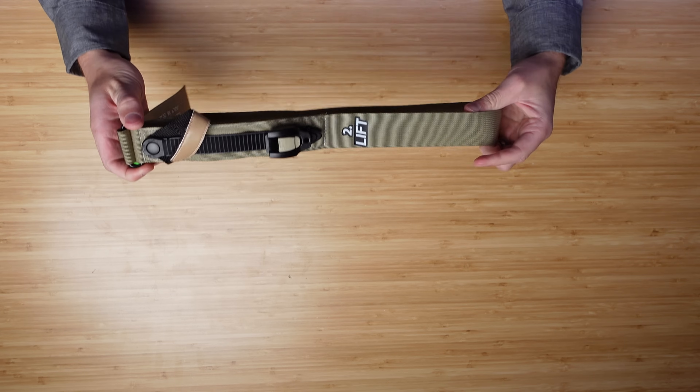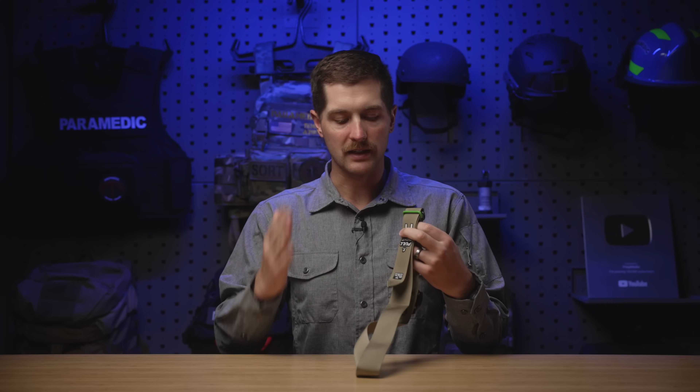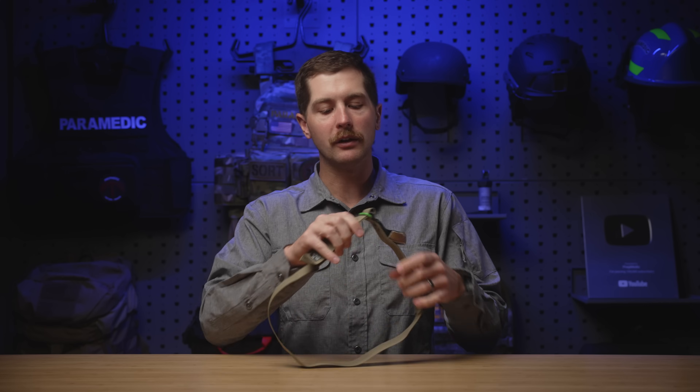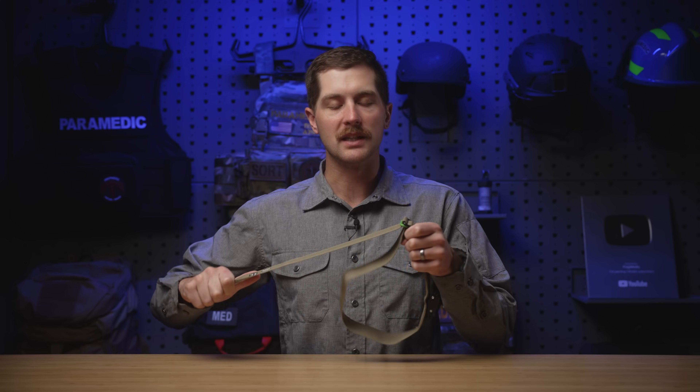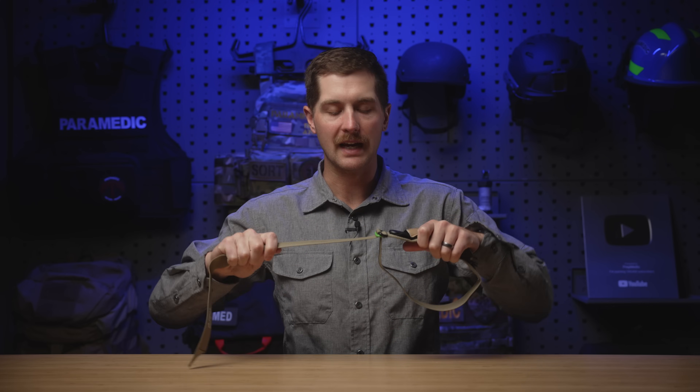Let's talk about use and why I like it and what some of its limitations are. This tourniquet is placed like any other tourniquet. It does not have a Velcro latch, which brings me to the first use case: if you are doing any kind of aquatic operations, you're a scuba diver, you spearfish, or you're somewhere with lots of mud, dirt, or grime, I really like these friction locks because they're not going to get gummed up. The CAT tourniquet has two sides of Velcro, which works great, but once saturated with mud or water, that Velcro is not going to stick as well. This is going to maintain its tension and will have a lower failure rate, in my opinion.